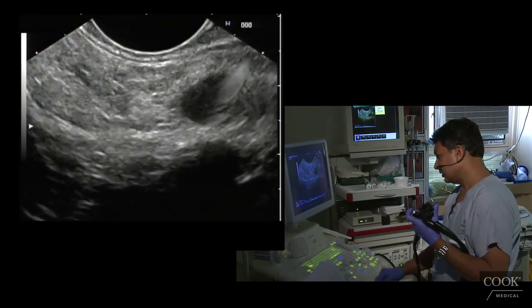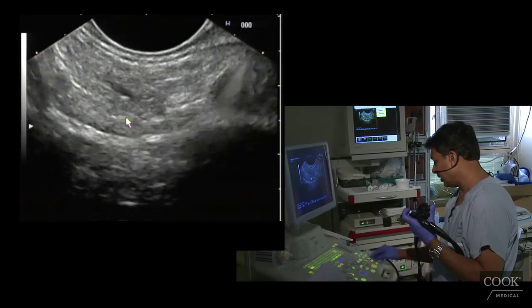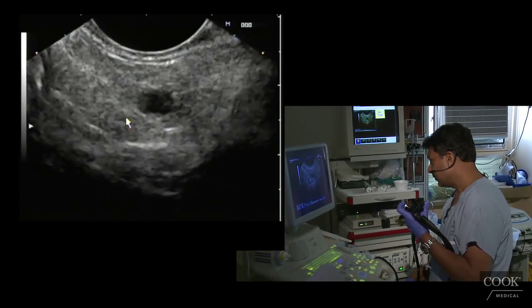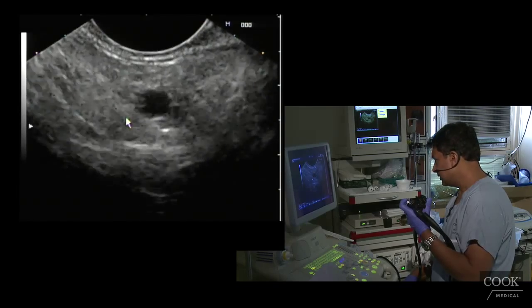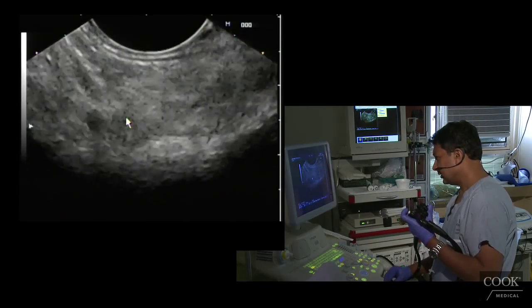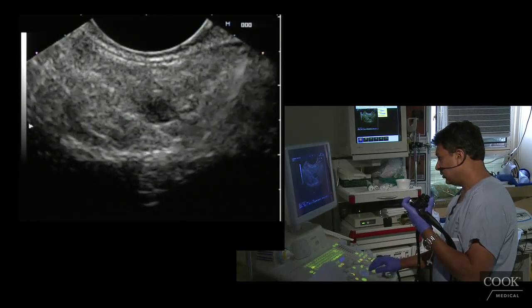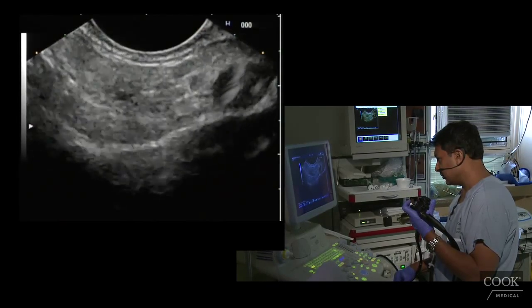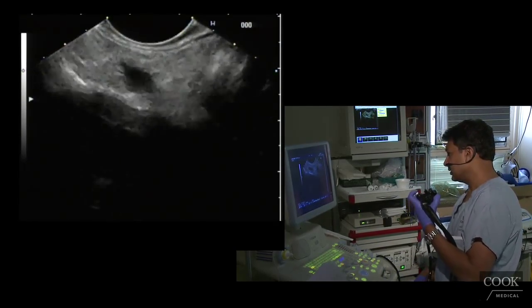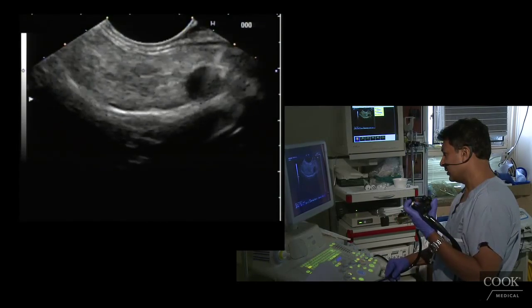That is very bizarre. See, it's all right in here. And that could be like a papillary formation that we're just not seeing properly. It's just this really short stricture. That is very strange. I don't know if it's evolved since last year. I have to look at the measurements from the last report. But I say that this dilation is really a malignant looking obstruction. You'll see this above tumors. So that's why I'm concerned about this.